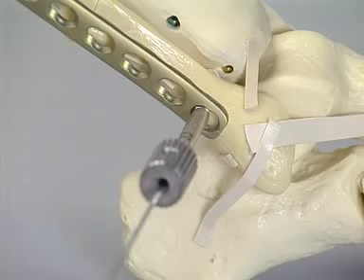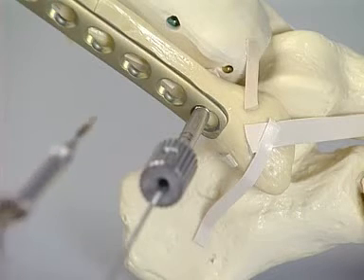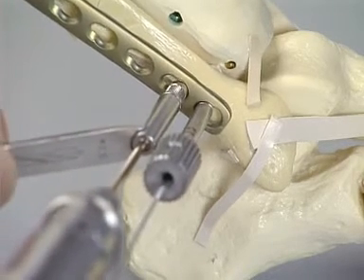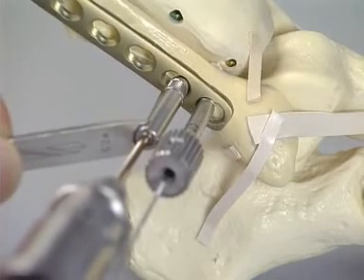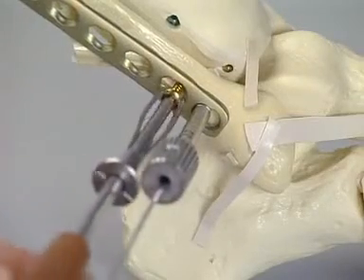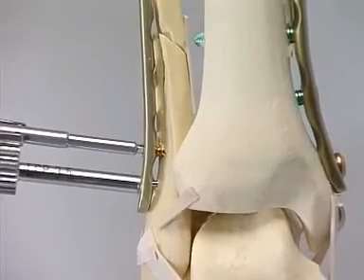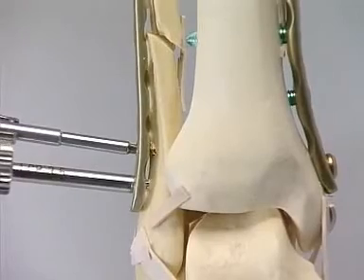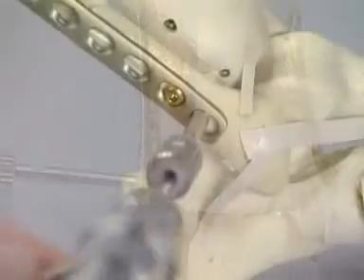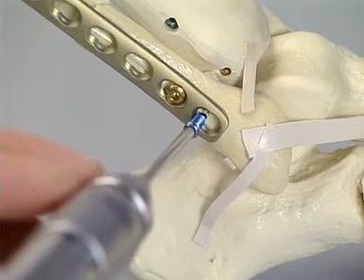In the distal region, the plate should lie as close to the fibula as possible to avoid restriction of the soft tissues. Therefore, a conventional cortex screw is first used. The hole is prepared with the 2.5 mm drill bit with measurement of the length, tapping of the thread, and insertion of the selected cortex screw. In this way, the fibula can be drawn towards the plate as desired. The K-wire and the threaded drill guide are removed, and a blue monocortical self-drilling locking head screw is screwed in.